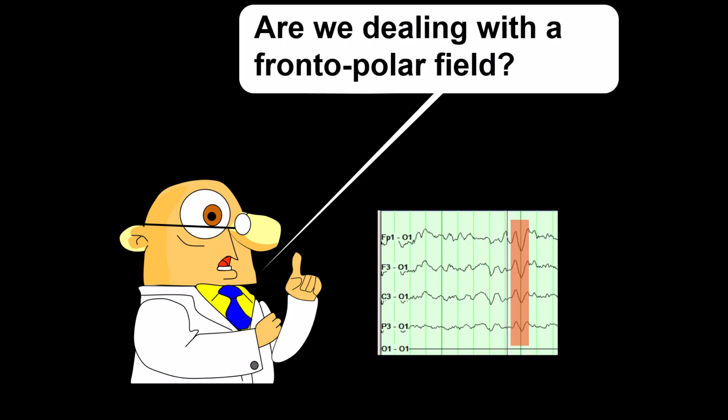So here I would like for you to answer this question. I think that your answer will be yes. And I am sure that you have already figured out not only the location of the generator, but also the polarity of the generator. Nevertheless, I will go through the logical process that it takes to get to the answer, because it is a good exercise to apply in a situation where the origin of the wave is well known, in order for us to apply it in those cases where the origin of the wave is not known.